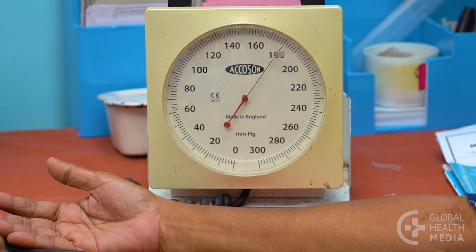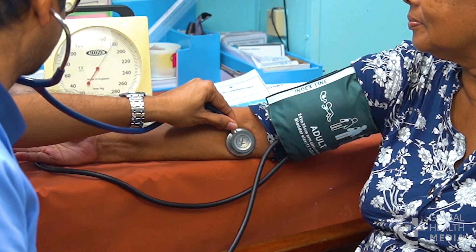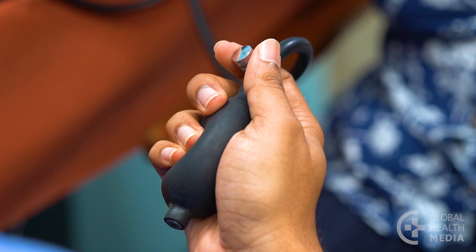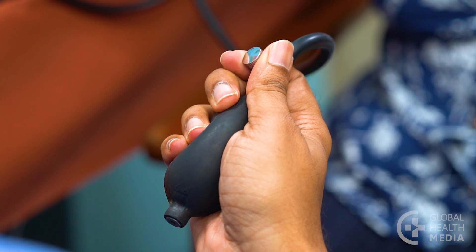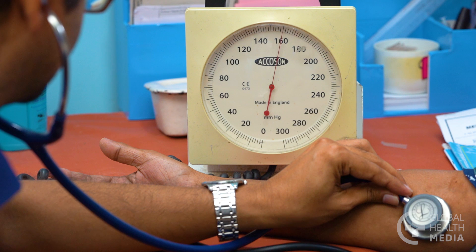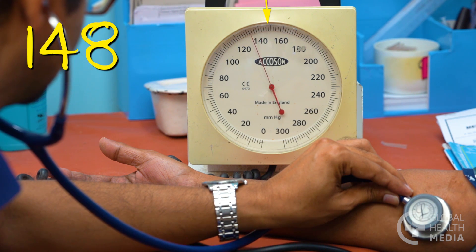Press your stethoscope over the location of the artery at the inside of the bend in the person's arm. Slowly and steadily release the valve and listen for the tapping sounds. The systolic blood pressure is the number when you first hear the heart sounds — this is the top number. The needle may move with the heartbeat, but the measurement is based on the sounds that we hear, not on what we see.